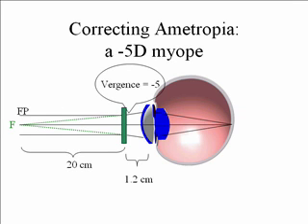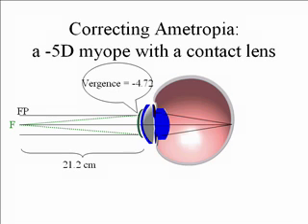So we've already seen this, but we'll do it once more. The vergence coming off of the back surface of the patient's spectacles in a -5 myope, and again, I'm defining a -5 myope as someone who wears -5 spectacles, the vergence coming off of the back of his lens is -5, but by the time that it hits his cornea, it is a vergence of only -4.72.